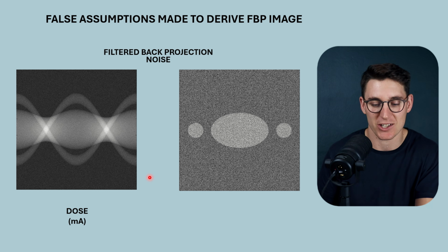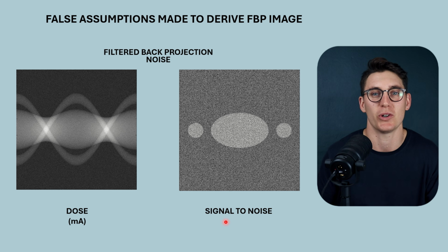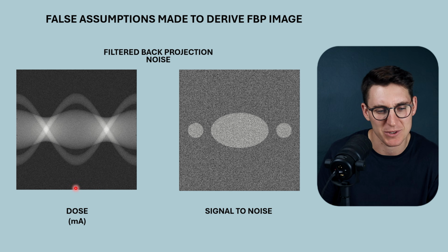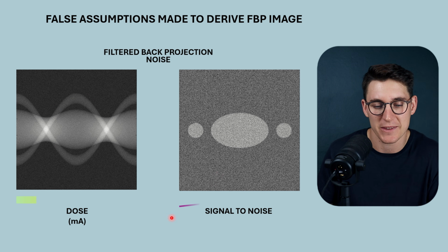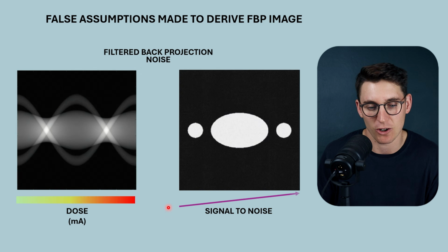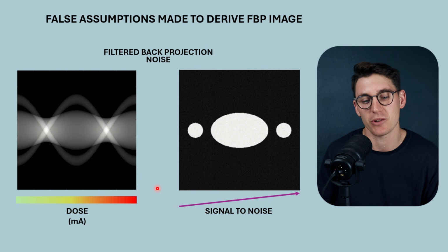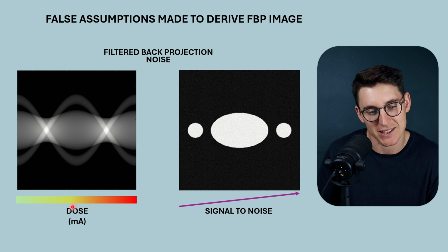With that increase in X-ray photons, we're going to get an increase in signal and an improvement in our signal to noise ratio. Watch how that happens here. I'm going to increase dose linearly here, see how the noise is reduced out of our sinogram here, and see how that changes the signal to noise ratio in the image that we ultimately produce here. Now, obviously, we're creating a better image. We're reducing the amount of noise relative to signal, but that comes at the expense of dose.